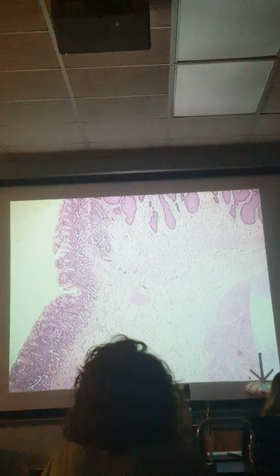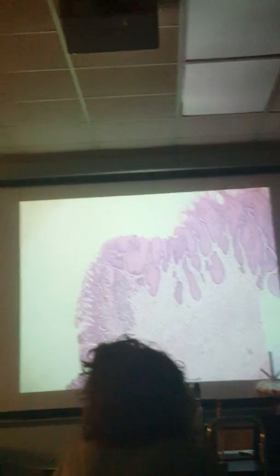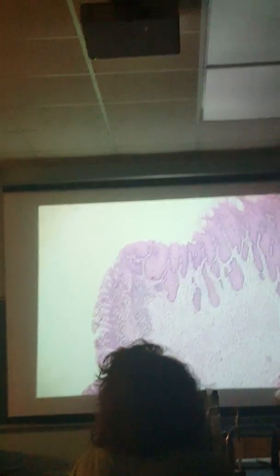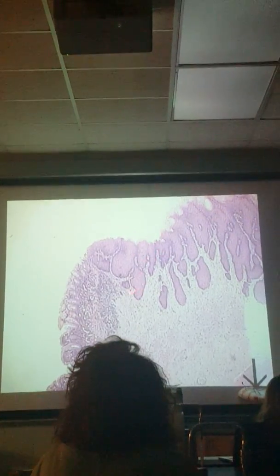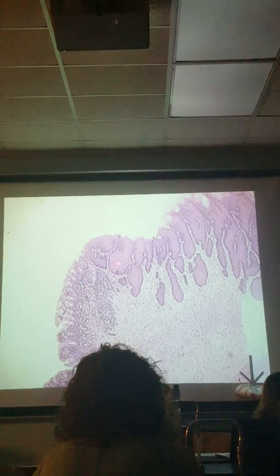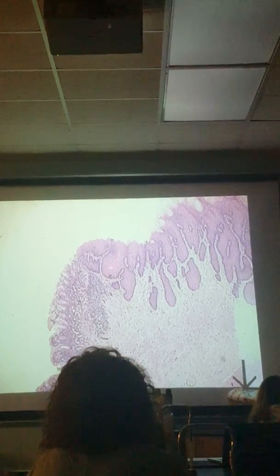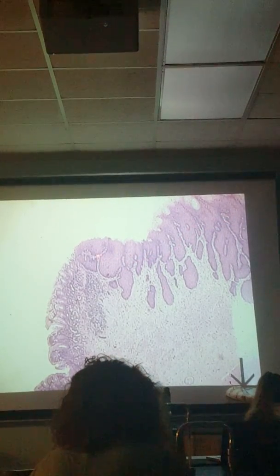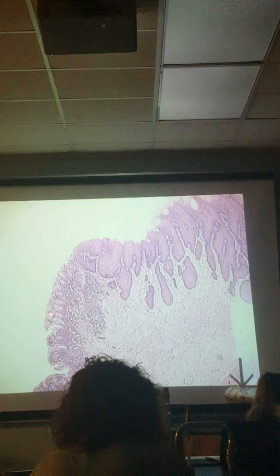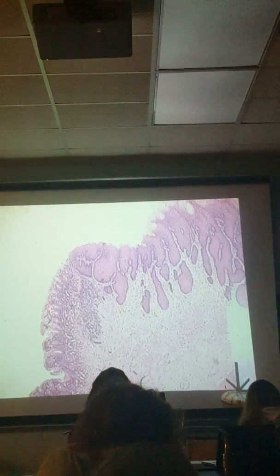Great. Let's look at this. So look at the epithelium. It looks quite different. So here it's kind of wrapped up and folded in on itself. But you see this is dense, and you see lots of layers. You see multiple layers. So this is esophagus. We've got stratified squamous. And then this looks different, right? It doesn't look the same. So something happened. We went from esophagus to something else.